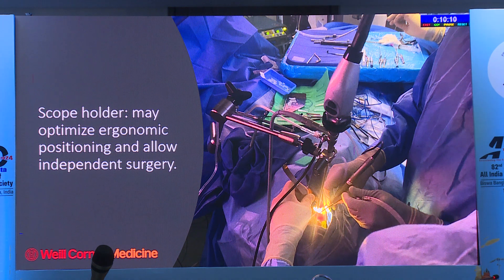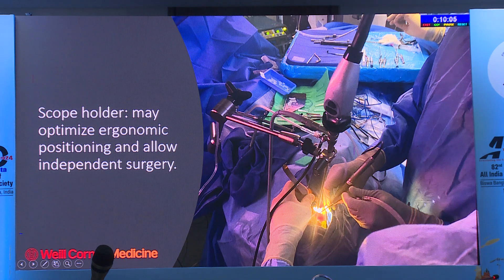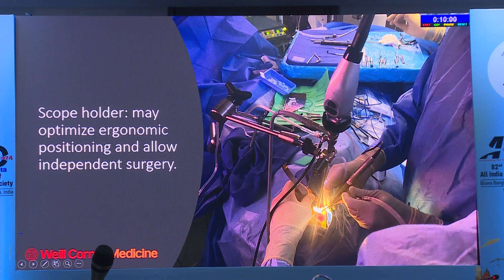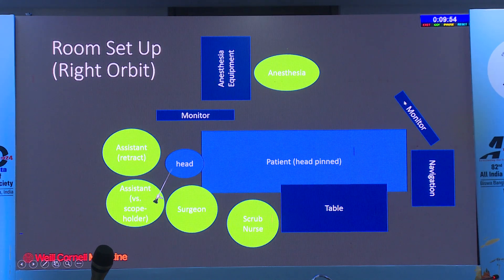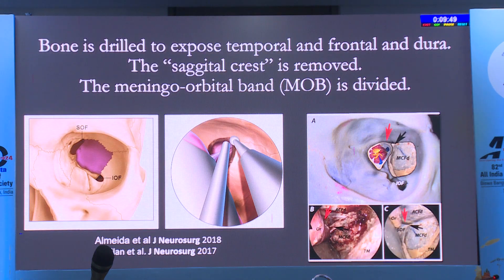The endoscope allows you to operate with just one assistant. The surgeon's left hand is holding the suction, the right hand is holding the drill, one assistant is retracting the orbital contents, and the endoscope holder shows the view. There's a monitor directly across from the surgeon and another at the foot of the bed for the assistant.